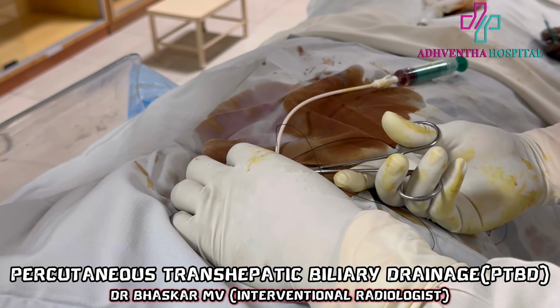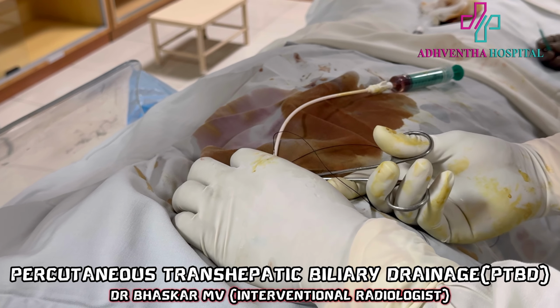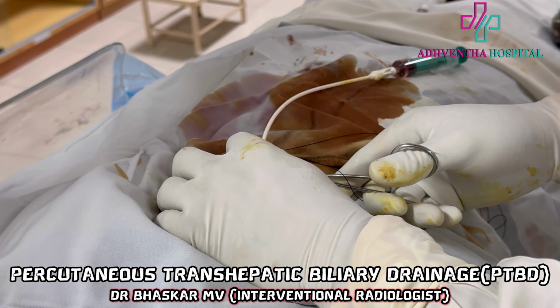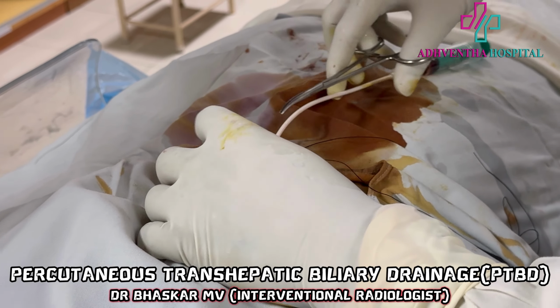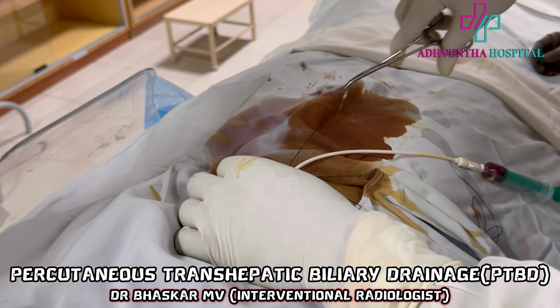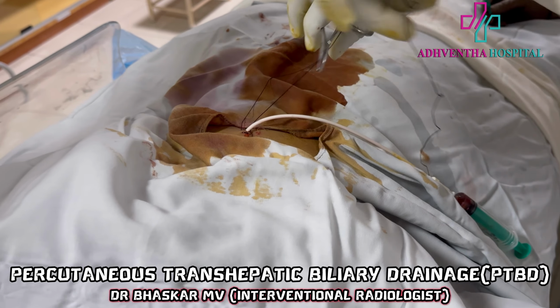Sometimes it can drain externally. But our aim is to reduce the jaundice, and later on we can put a stent also to relieve the obstruction permanently. So especially in malignancy, we put a metallic stent such that no recurrent obstruction will be there.